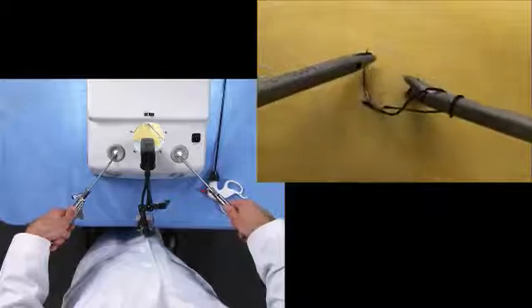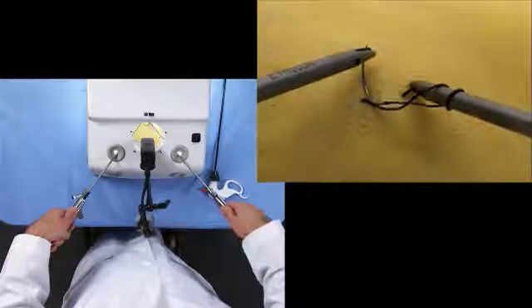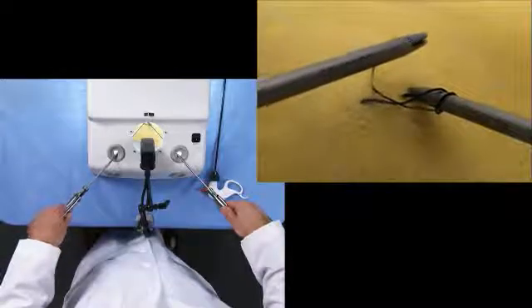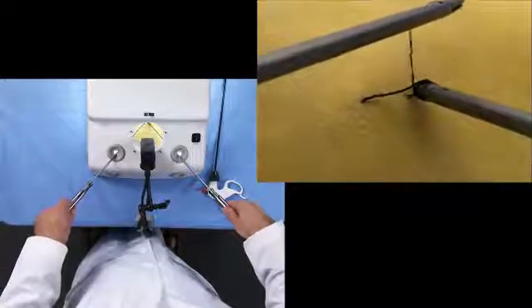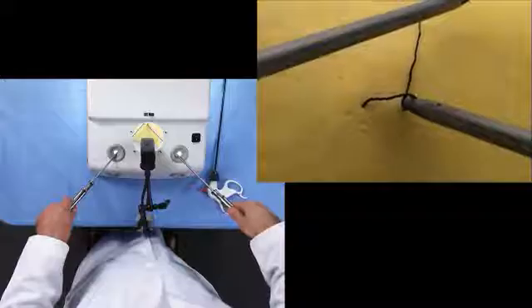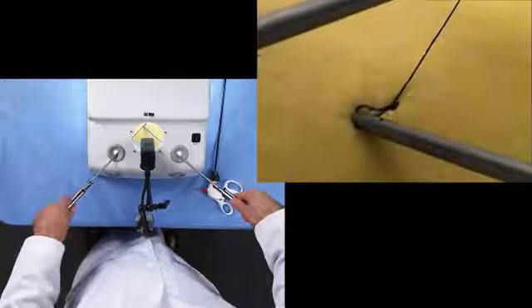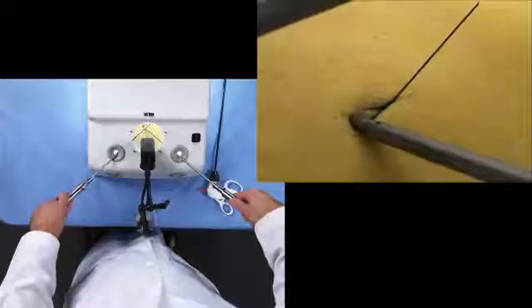grasping the very end of the tag. The left hand then rotates medially and moves to the 1 o'clock position, while the right hand moves up slightly and then back adjacent to the knot to allow us to have a very short tag.